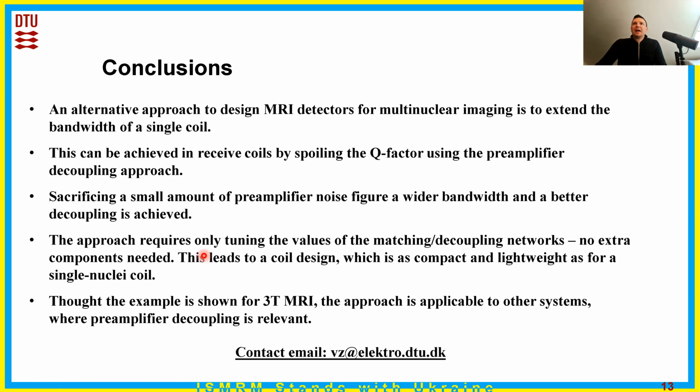In conclusion, the bandwidth of an MRI detector can be extended by spoiling the Q factor of the resonator. If you want to know more details, you are welcome to contact me by this email.